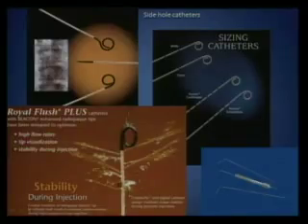When you make a hole, that plastic piece actually goes inside this. And this is something to push that piece out. So before you use that catheter, you always have to be sure where that piece has gone. The other thing you do is you do not flush that catheter beforehand. You make the hole first and then you flush it, so that in case it was inside the catheter, it still comes out. But you have got to find this hole.